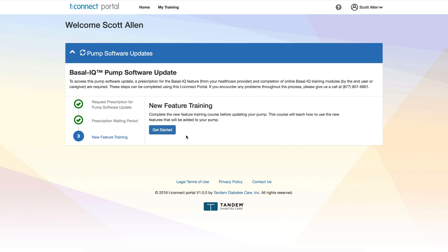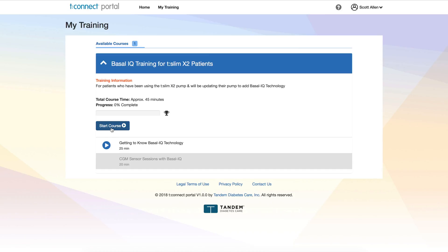It says complete this new feature training course before updating your pump — this course will teach you how to use the new features added to your pump. Basal IQ training for TSlim X2 patients, for patients who have been using the TSlim X2 pump and will be updating to add Basal IQ technology. Total course time approximately 45 minutes. Let's get started.